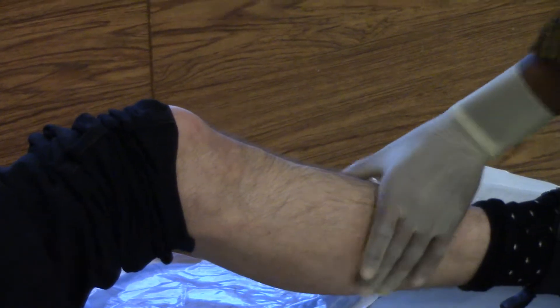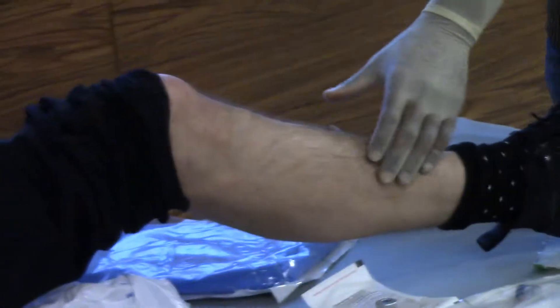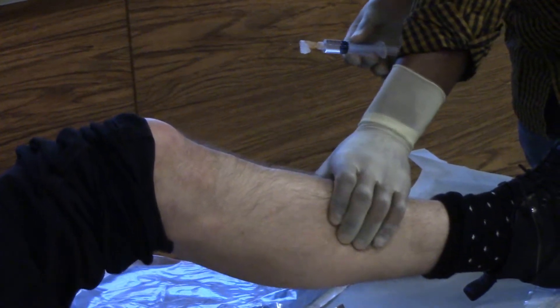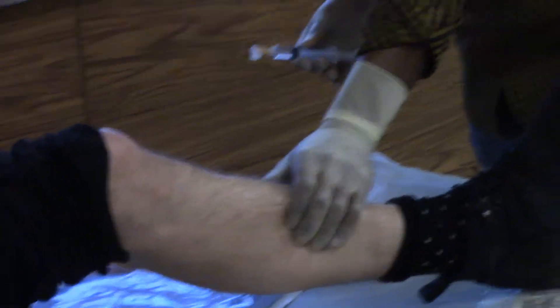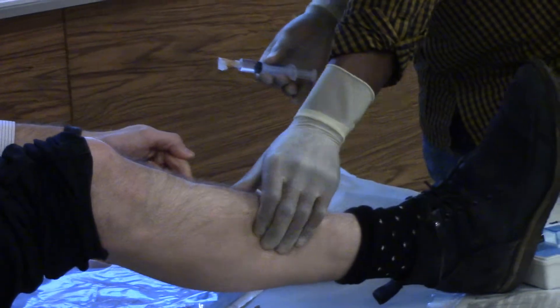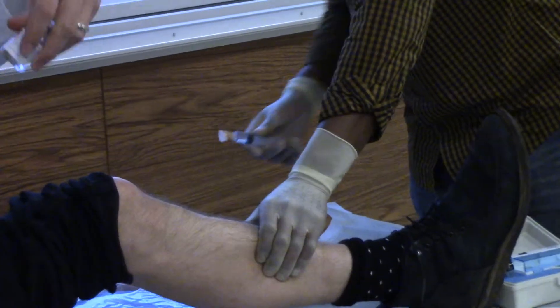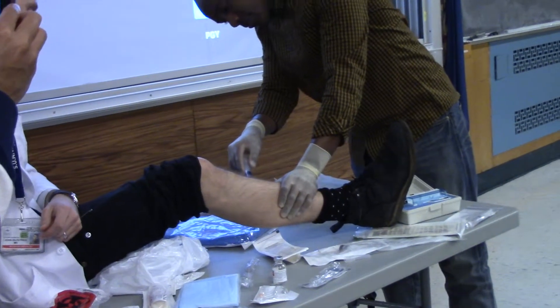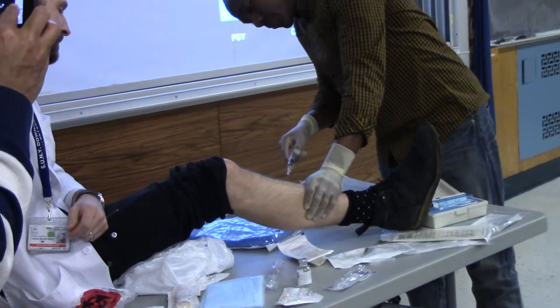Actually, it doesn't burn at all. Did you clean that side? He didn't actually put any lidocaine in it. Did he clean that side? He didn't clean it down that side. I'm just making sure.